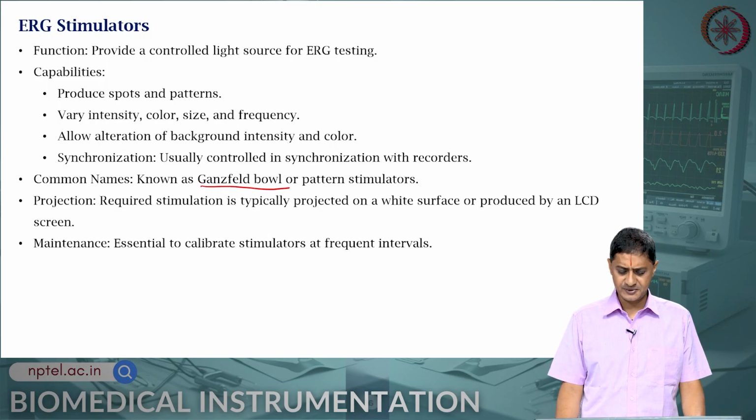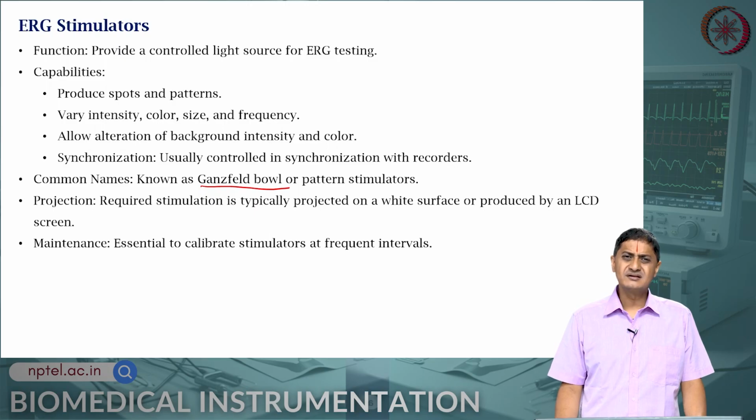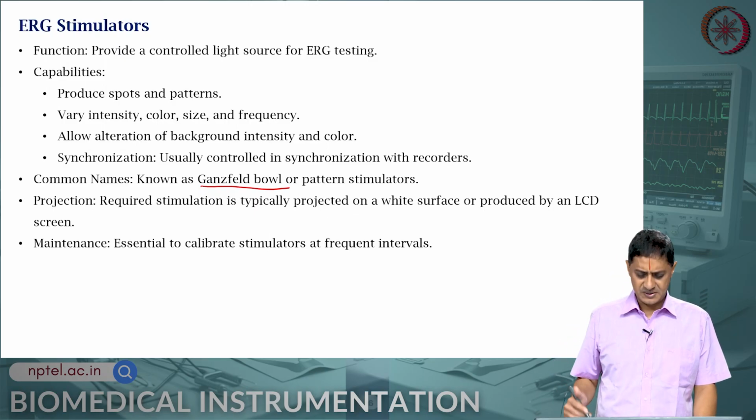Required stimulation is typically projected on a white surface or produced by an LCD screen. It is critical to keep calibrating this equipment from time to time.